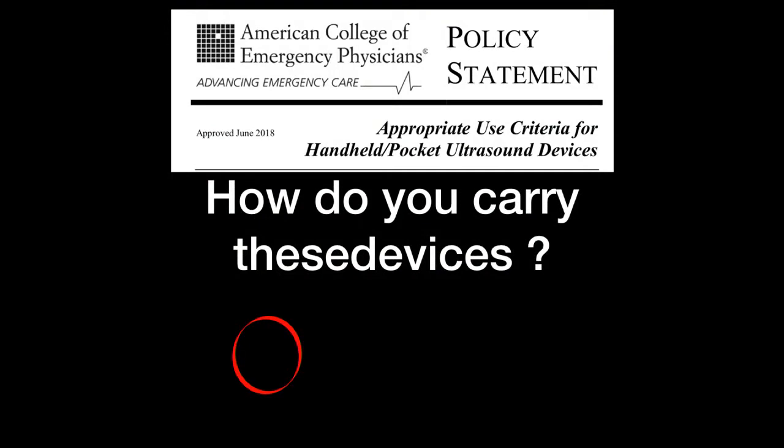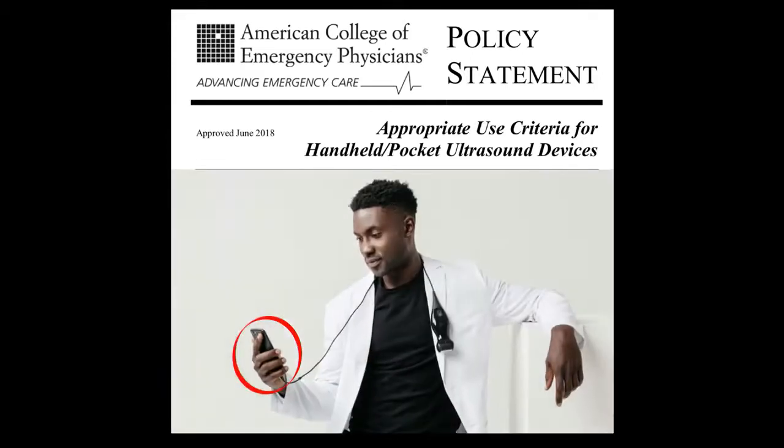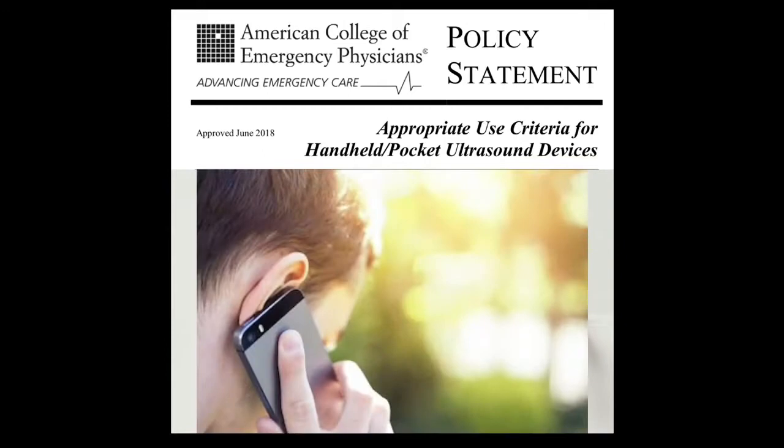So from those of you that actually have used the system, it's great because you can go to the bedside, use the machine in the bedside, but what's the major hindrance that you have? Well, you use the system, and then you finish with the system, and are you carrying something on your hand also to clean the machine, or you still have to go outside and try to clean the machines or clean the system, right? So the majority of you are going to be putting that where? In your pockets? Or if you're really intuitive, you might just put it around your neck, right? And that actually brings another connotation, right? If you're going to put that around your neck, that's the same system you're going to be using later to talk to your family members or somebody else.